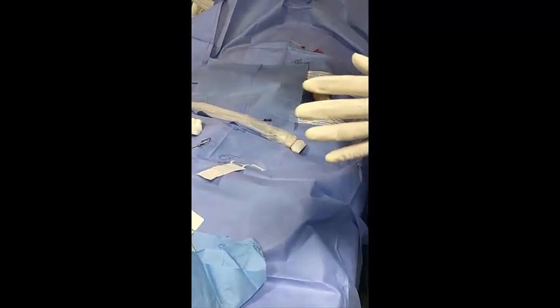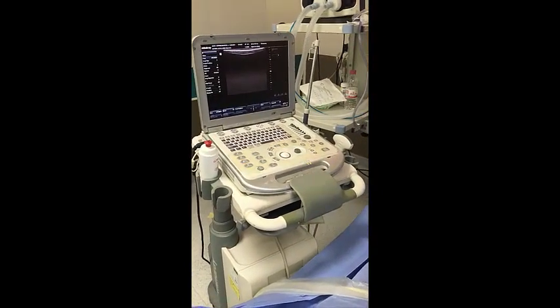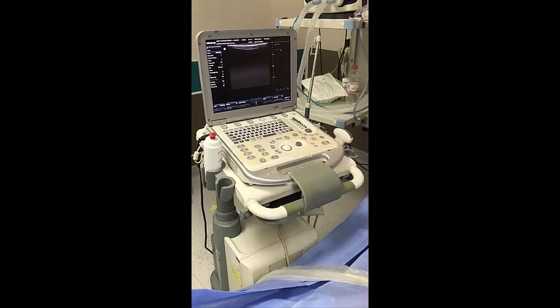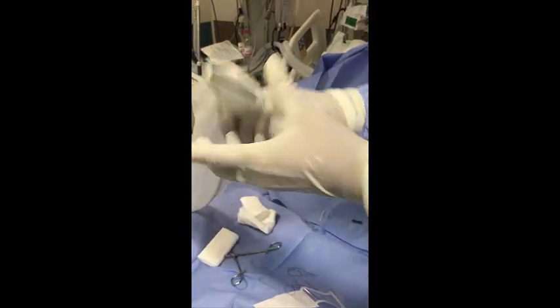After that, this is the machine. The setting should be on upper extremities arterial, and the software will bring the best image for the artery. The probe here — low and high frequency probe, as you all know — should be covered by a sterile cover.